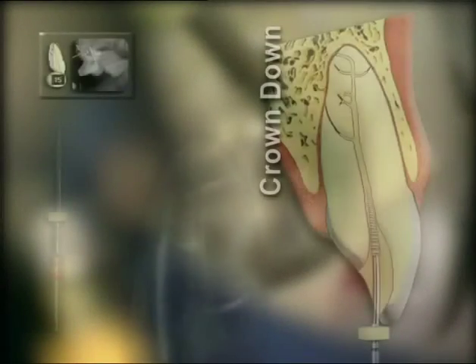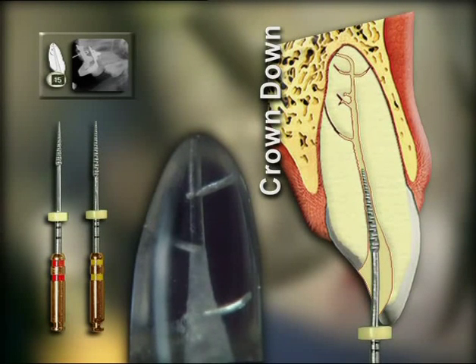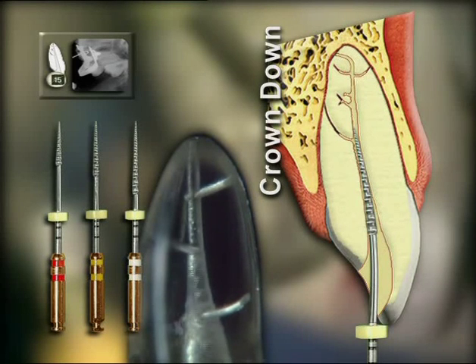Dentin shavings are carried out of the canals, while the guiding tips seek out the canal and prevent apical transportation. These files avoid the risk of over-enlargement in the coronal portions of canals, giving us predefined canal taper. The GT rotary files are used in a crown-down technique, starting with the instrument of the biggest taper and moving to the instruments with smaller taper. This allows only a small surface area of the instrument to get in direct contact with the canal walls, thus reducing the risk of fracture or ledging.